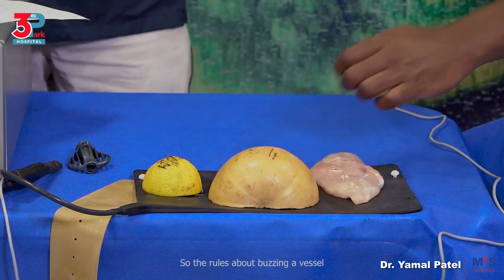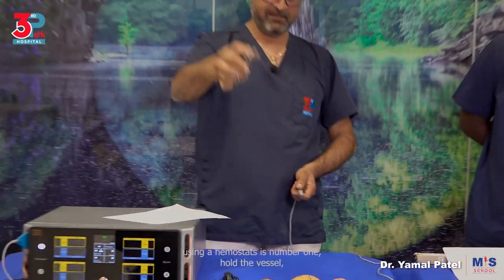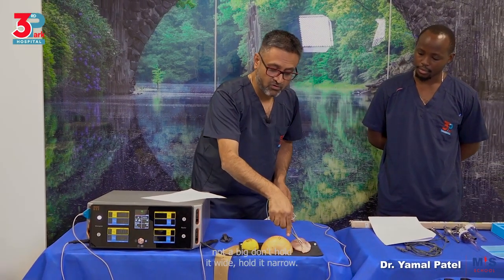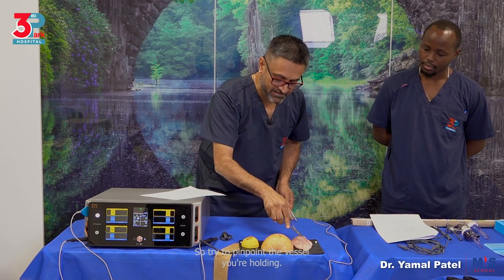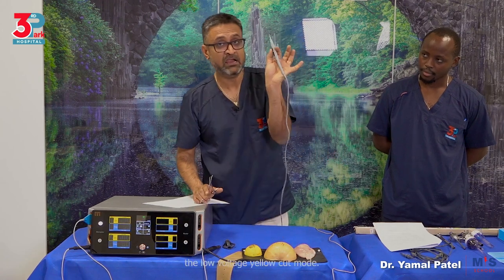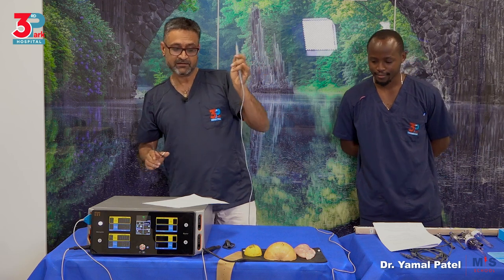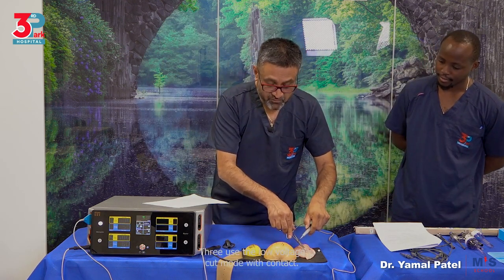So the rules about buzzing a vessel using a hemostat are, number one, hold the vessel, but don't hold it wide, hold it narrow. So try to pinpoint the vessel you're holding. Second thing is use the low voltage yellow cut mode. Third, use the low voltage cut mode with contact.